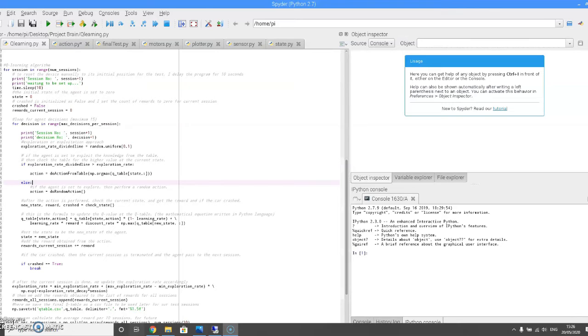Within each session, first the agent will decide whether to explore or exploit the environment. After it decides how to make the action, then we will check the state. From the state we will get the new state, the reward, and if the car crashed. With this information, we can then update the Q-table with the key pair of state and action, set the current state to the new state, and save the current rewards for the current session. If the car crashed, then the session is broken and we pass to the next session.